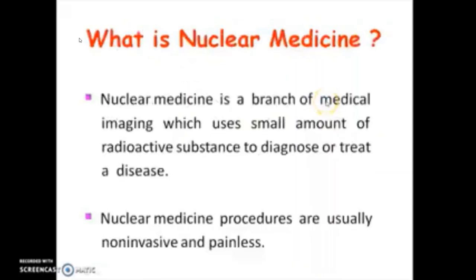Let us see now what is nuclear medicine. Nuclear medicine is a branch of medical imaging which uses a small amount of radioactive material for diagnosing or treating a disease. Nuclear medicine procedures are usually non-invasive and painless.